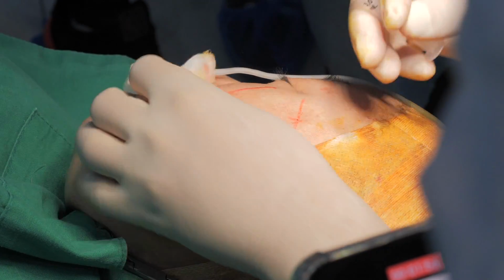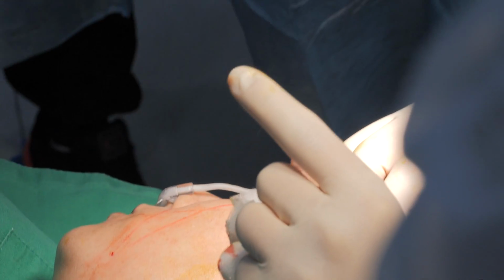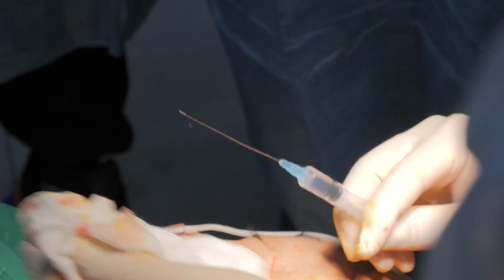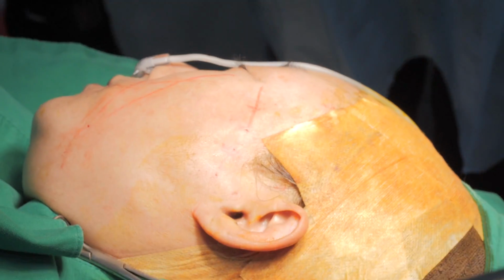Again, it's not a needle. It's a cannula. Seven centimeters long, 23 gauge cannula. It's very useful to infiltrate the tumescent solution. Alright, number 3, please.